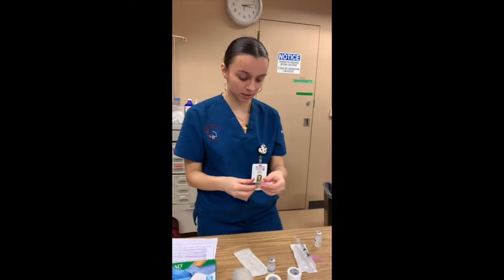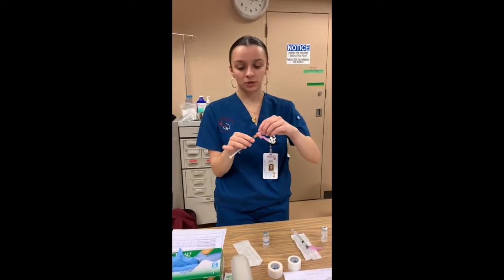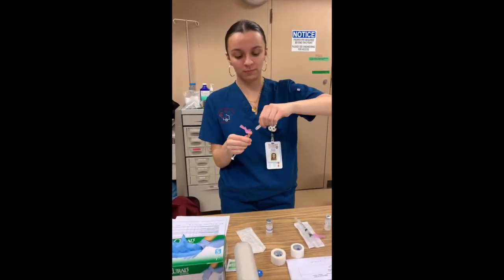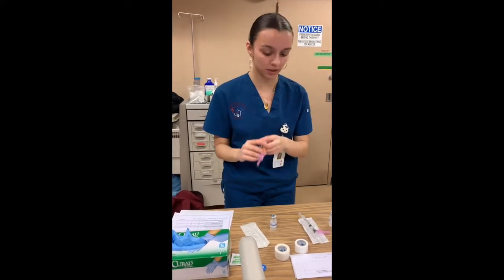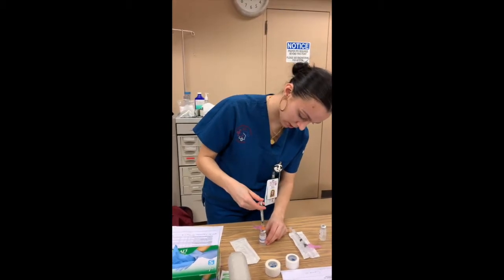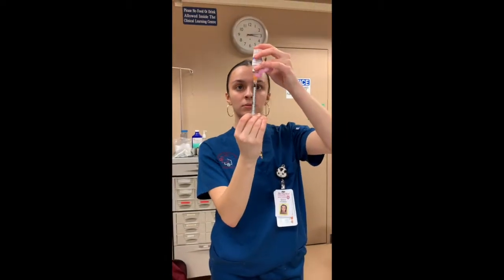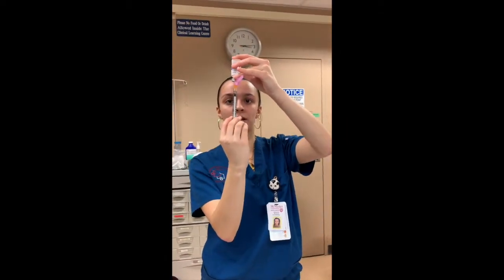So I'm going to take the subcutaneous. Okay, so next I'm just going to start with my subcutaneous one. So I'm just going to take off the cap, and what I'm going to be doing, I'm just going to be putting the 0.5 milliliters of air in first, and then I'm going to draw the 1 milliliters, which is the dose for Mr. Mancini. So I'm going to stick it in. I'm going to give the air inside, and I'm just going to draw the 1 milliliters now. I just want to make sure I'm not getting any air bubbles in.